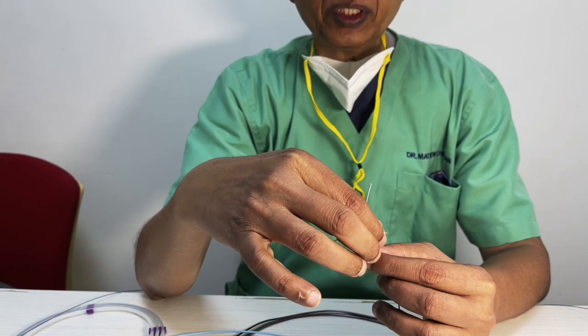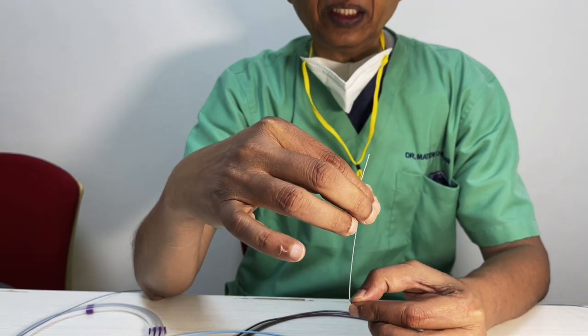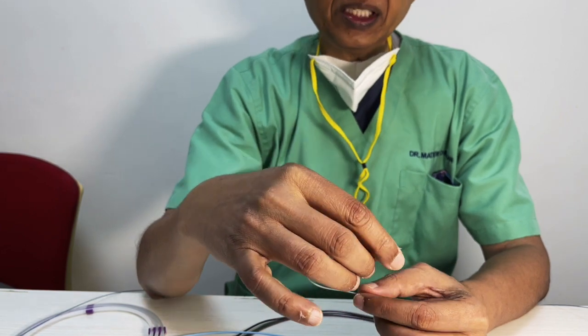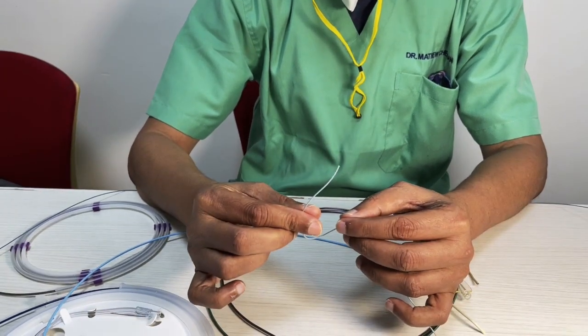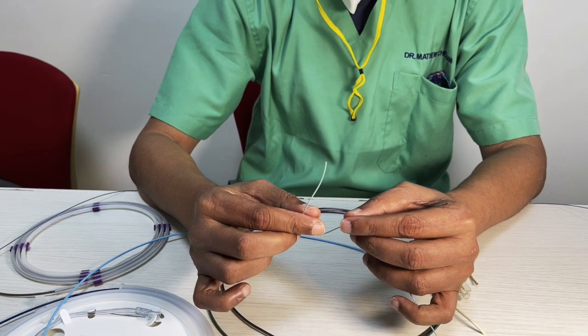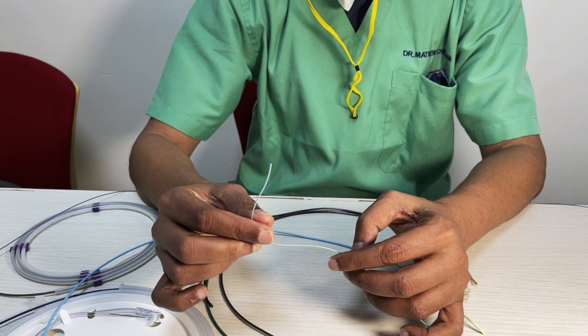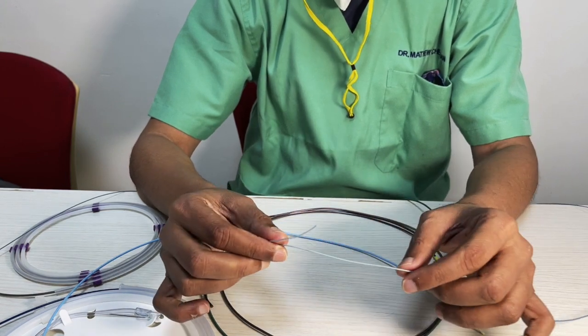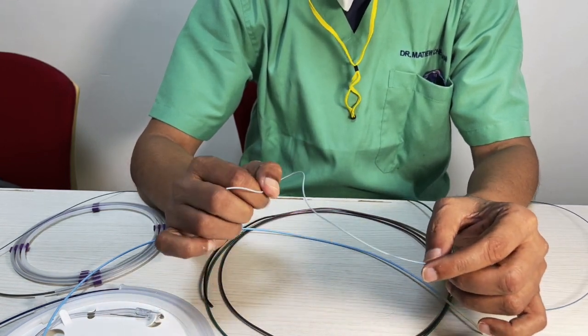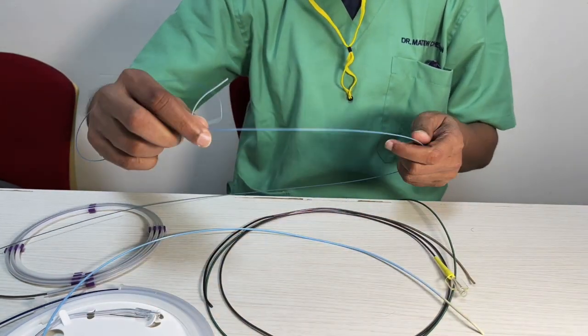Also, when I want to reposition the catheter, the loop will straighten and straighten and straighten, and suddenly the whole catheter will drop back. Now these are very disturbing when you're working in vessels where the tip has to be aligned exactly close to, say, for example, a ruptured aneurysm. You don't want a sudden forward thrust. And that is why we require these devices as distal as possible. So we loosely use it as a term, support. Now, having said that, let's just go back to the guiding catheter.